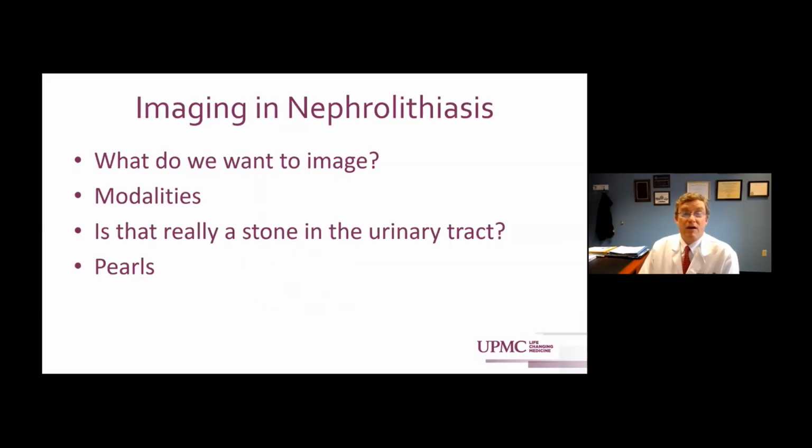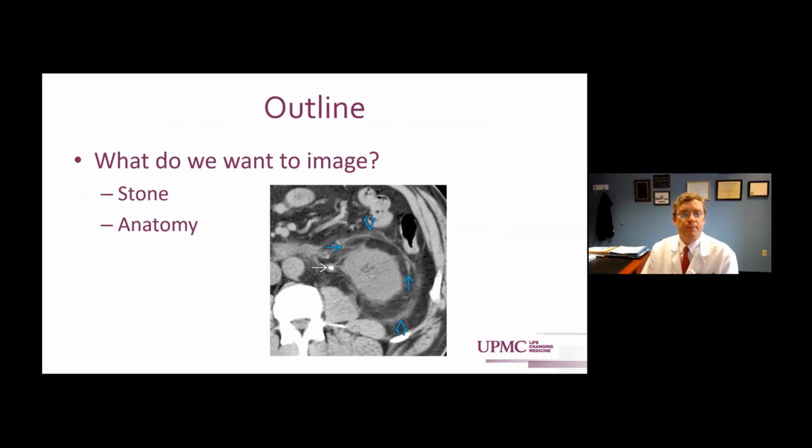Just briefly, I'm going to talk about, with respect to nephrolithiasis, what do we actually want to image? What are the modalities that we have? And then we'll have a little fun and talk about some of my favorite topics. Is that really a stone in the urinary tract? And then a few pearls that some of my residents had asked me to possibly share.